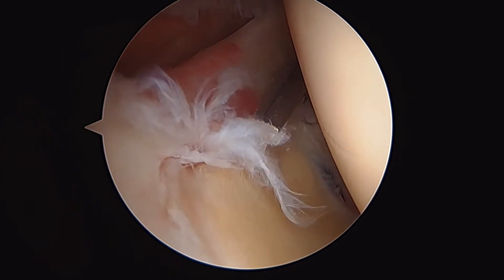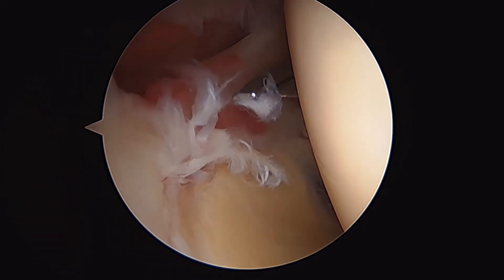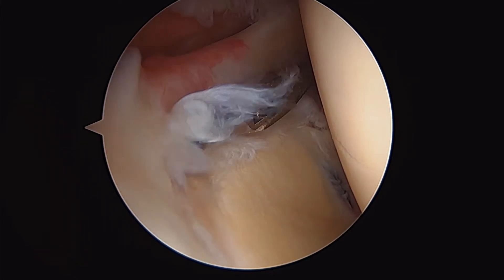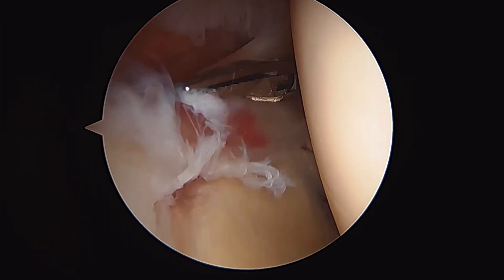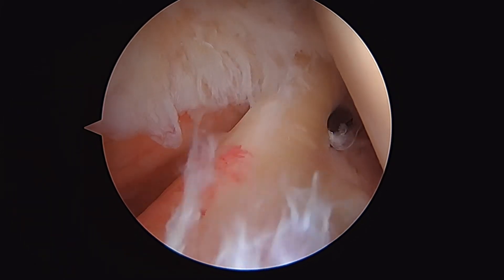So this is where the pathology is in this patient. This is a superior labral tear, anterior to posterior, also known as a SLAP tear of the shoulder. This is right where the long-headed biceps, which you can see right here, attaches to the superior labrum.